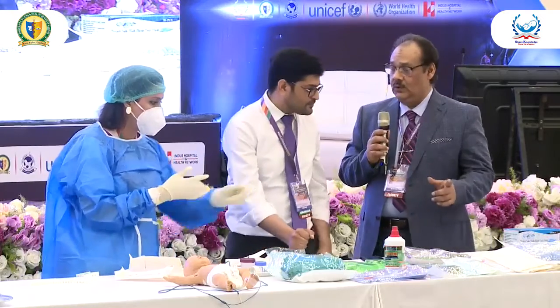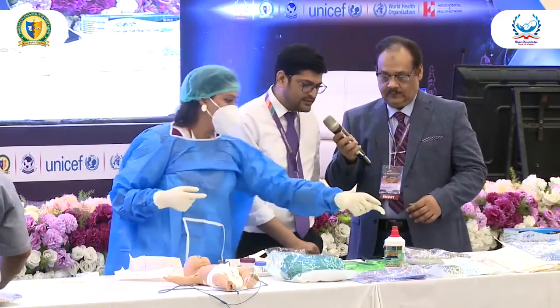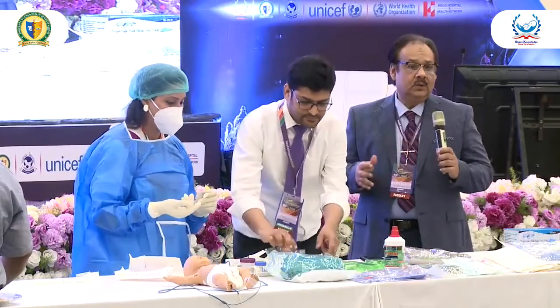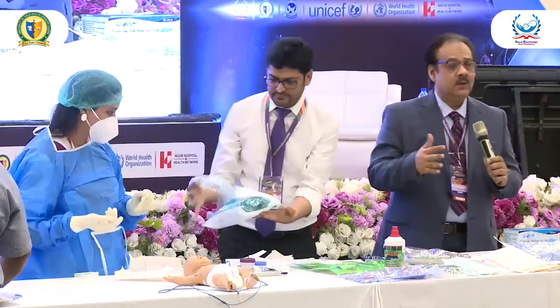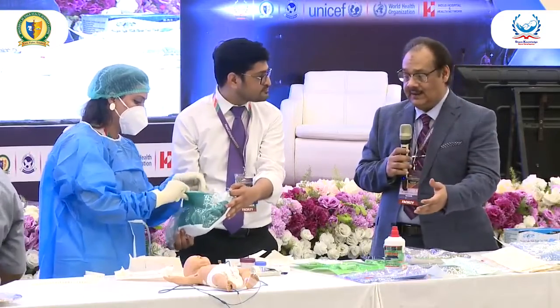So you don't have chlorhexidine in your unit? It's not available. Well, we use povidone iodine or alcohol. Okay. So as I said, if you have chlorhexidine, use chlorhexidine. If you don't have it, then use iodine.